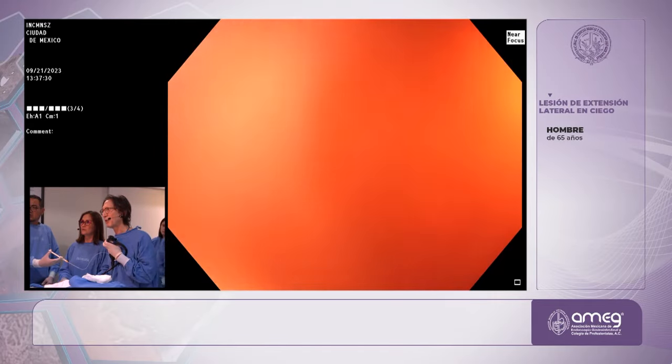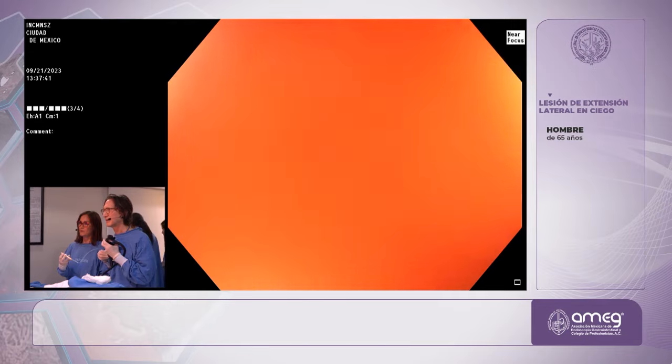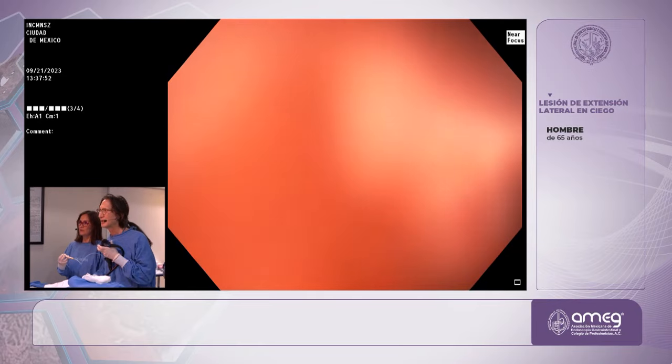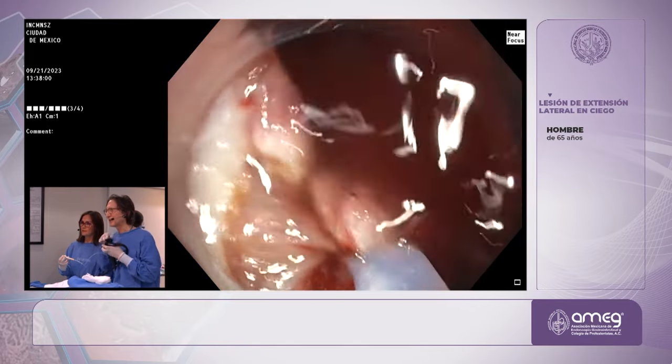Now, you really need a water pump that is very strong. But go ahead and start to close, please. Close. Because when you have really vigorous water irrigation, then it clears out the blood more easily. So this is the cloudy view here that we hate. Are you closed now? Yes. Okay, so let's take a look then.